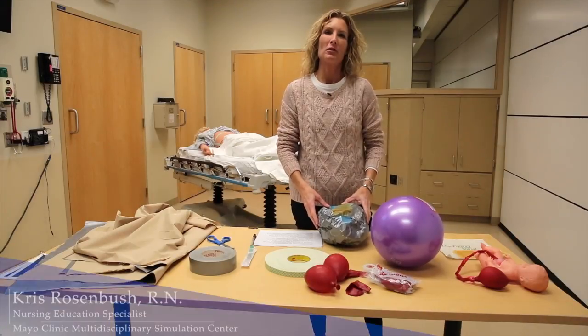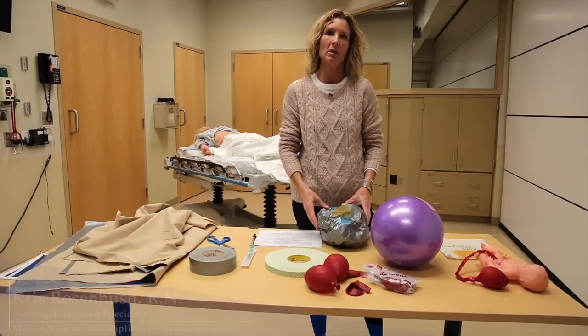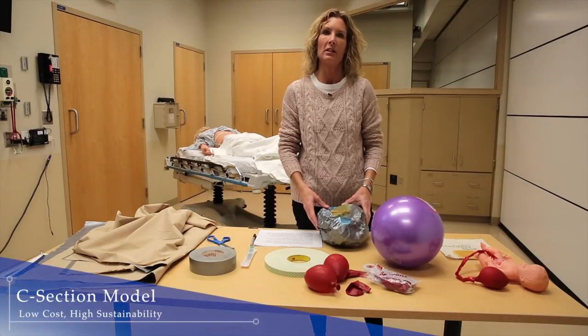Hello, my name is Chris Rosenbush. I am a nursing education specialist at the Rochester Mayo Multidisciplinary Simulation Center, and I am here today to show you how to build a low fidelity cesarean section model.